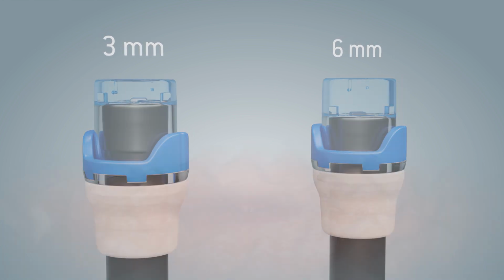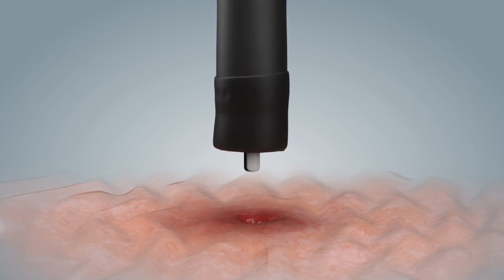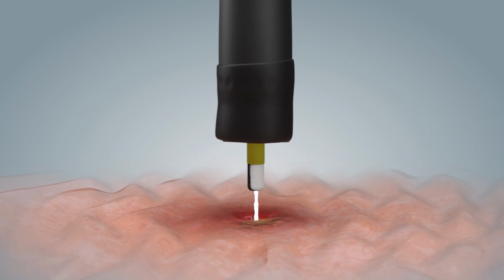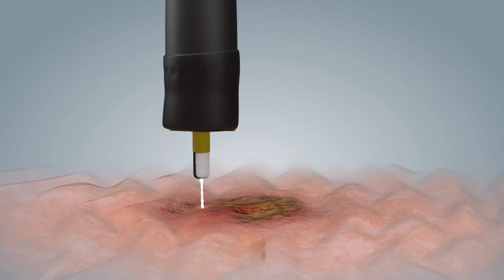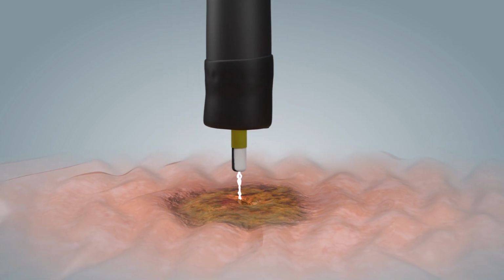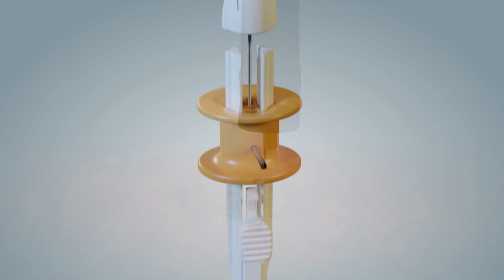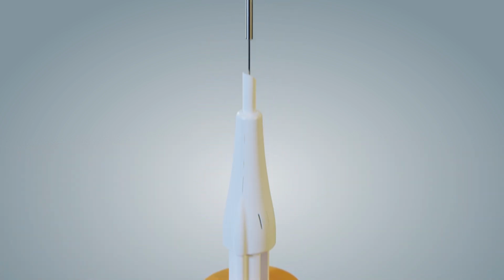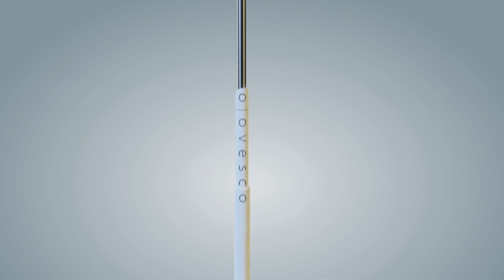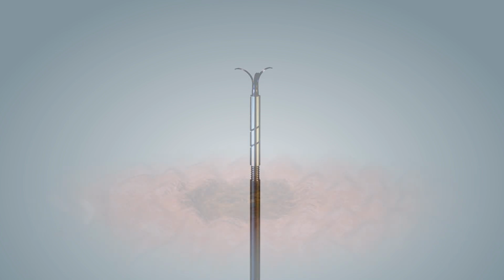When closing gastrointestinal fistulas with OTSC Neo, the tissue is prepared by freshening or debridement of the fistula opening and fistula tract, for example with APC, to support the healing process after closure with the OTSC Neo clip. The OTSC anchor can facilitate mobilization of the fistula opening into the cap as an application aid. It can be used with both 3 mm and 6 mm cap depths.